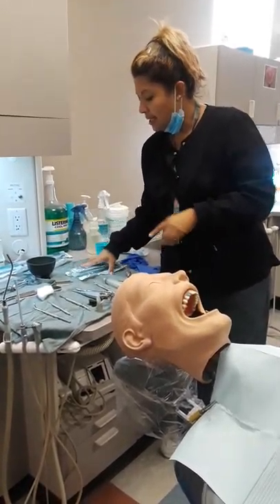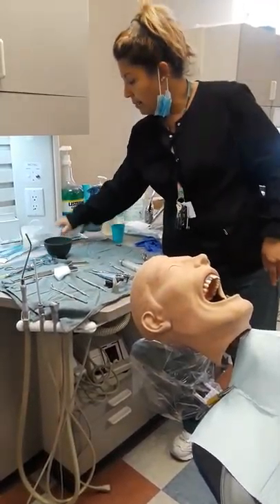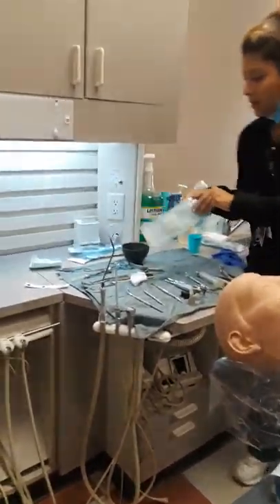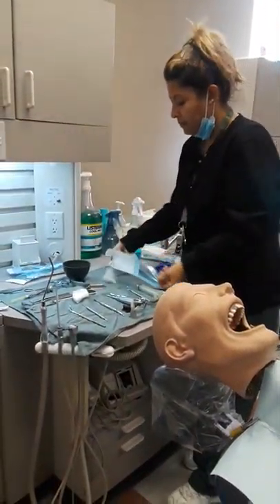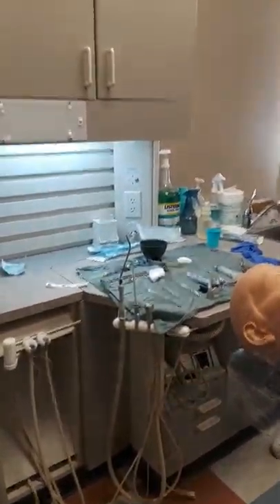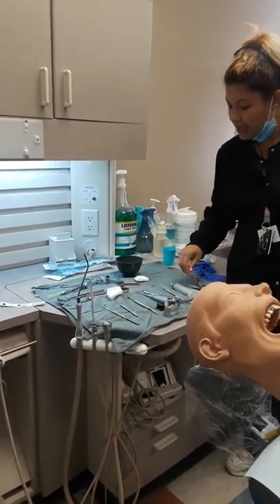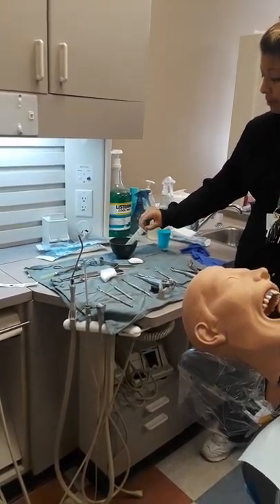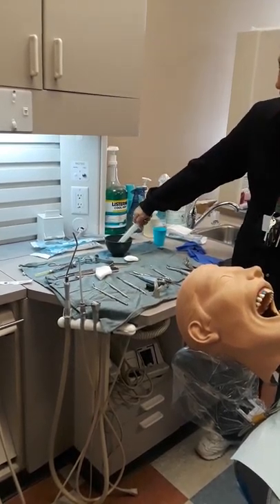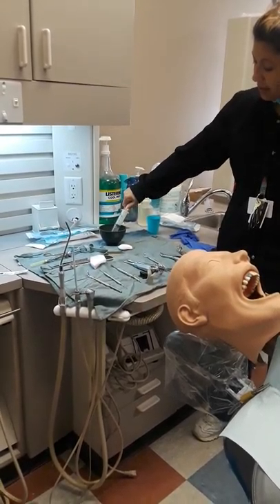Everything else is going to stay in my bag. Remember the dental assistant's curse: I am set up, ready to go, if we turn into surgery. I have sterile gauze for me, and sterile gauze for my patient to take home after the treatment's over. So I have this ready to go just in case this turns into surgery. I can now keep this in the bowl, and again we fill with one hand.